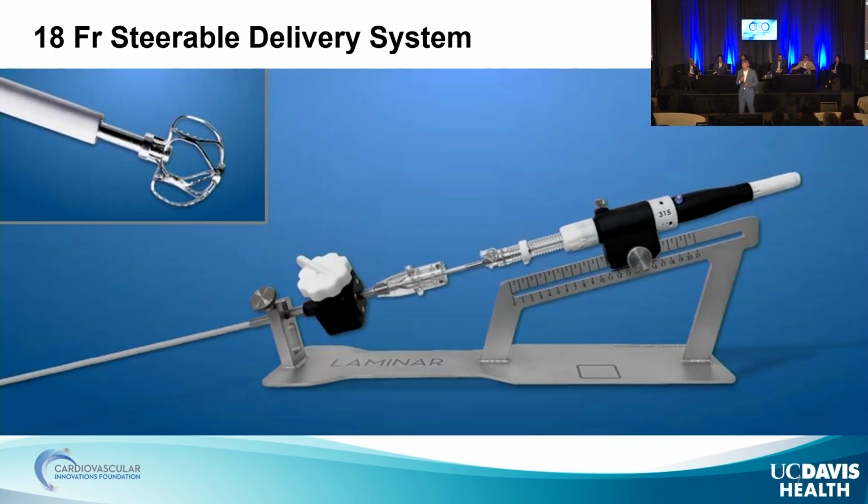No, I'm not sure what that. No, because the ball and the lock are locked to one another, so they can't rotate independent of each other. So when the tissue's locked, it doesn't rotate.